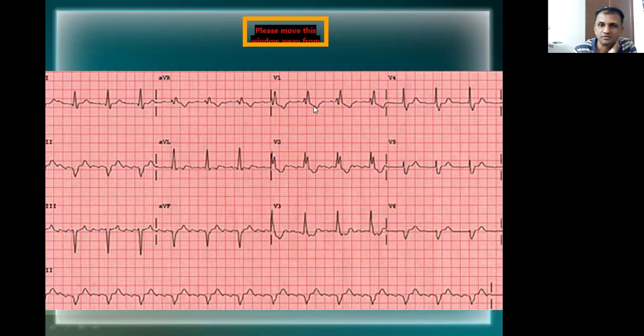So this we have already seen. I'm sure all of you will be able to answer this one. Bundle branch block. RBBB, right bundle. Good, good, excellent.